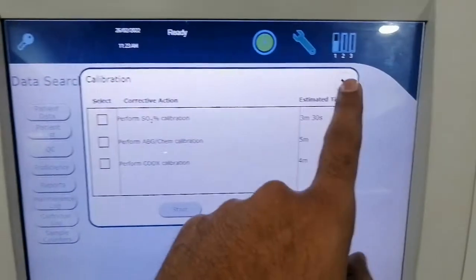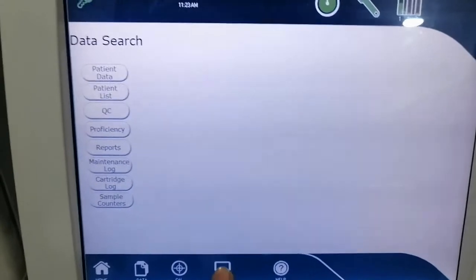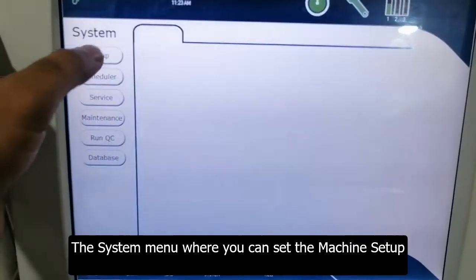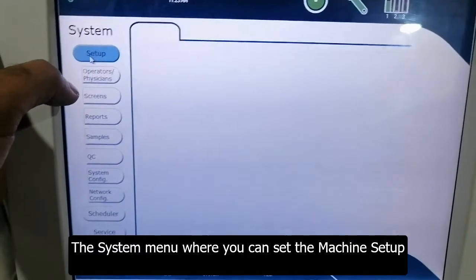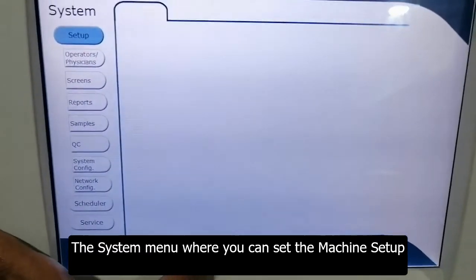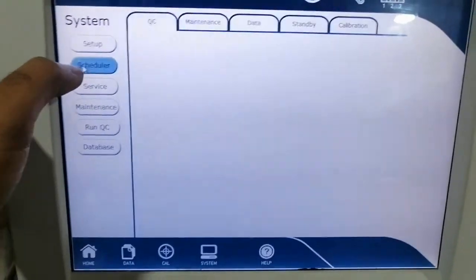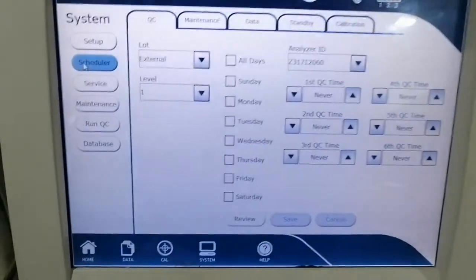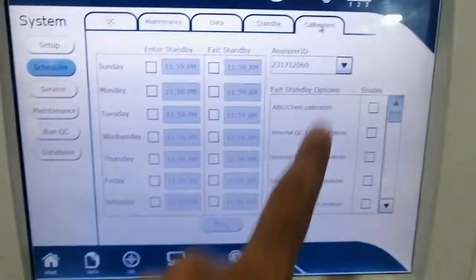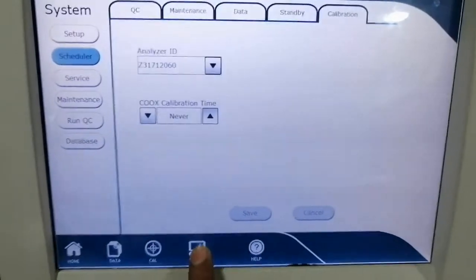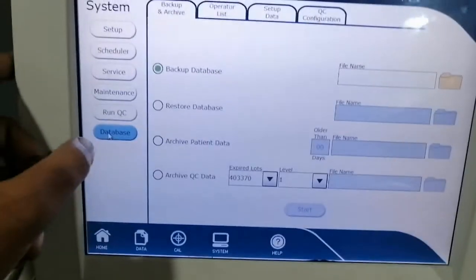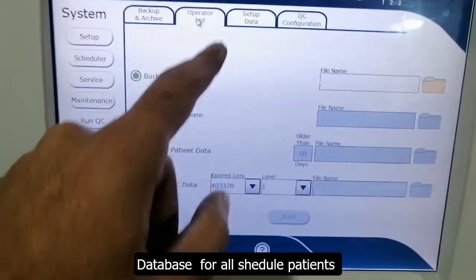This is the system menu where you check the setup of the system — screen reports, sample quality control, and other parameters — including scheduled maintenance, standby calibrations, and date settings. This is the database for backup data of patients and the operator list.